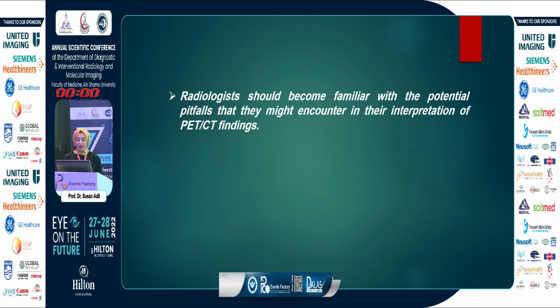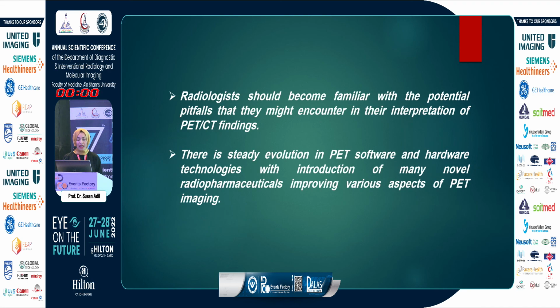Radiologists should be aware of the pitfalls that may be encountered during interpretation, and there is a steady evolution in PET software and hardware technologies, with the introduction of many novel radiopharmaceuticals that improve various aspects of PET imaging.